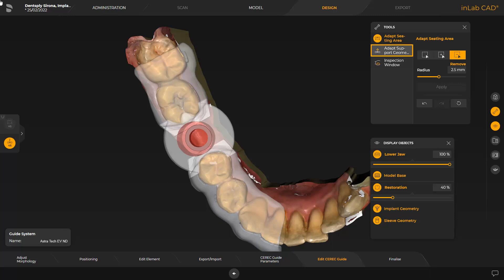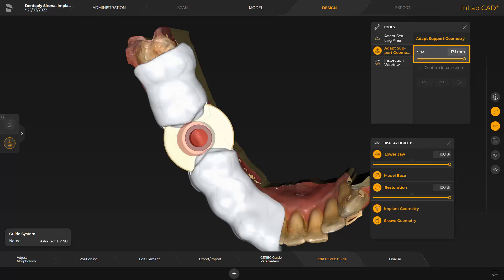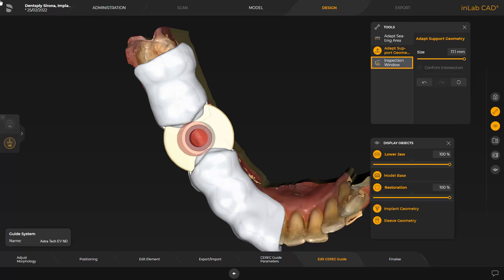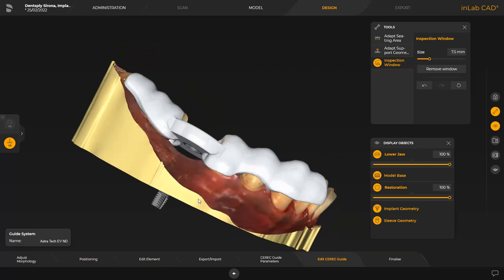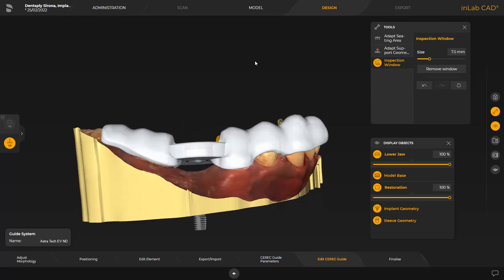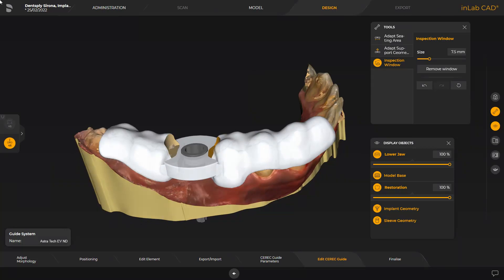Next, we switch to the Adapt Support Geometry tool. The slider allows you to decrease or increase the support geometry radius. As an alternative, we tap the support geometry and can then make modifications by dragging the mouse. The last tool in this step allows you to place inspection windows. To begin with, we place two windows proximal to the surgical guide sleeve respectively. This can be of advantage in narrow spaces. In our case, this has made the warning disappear.